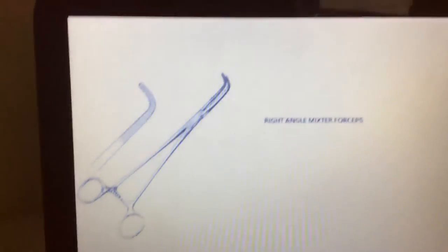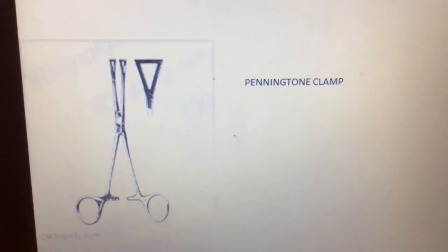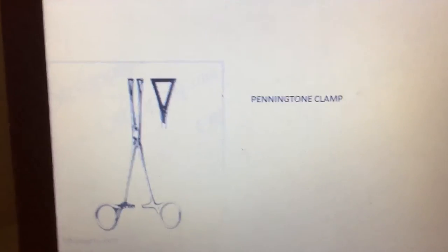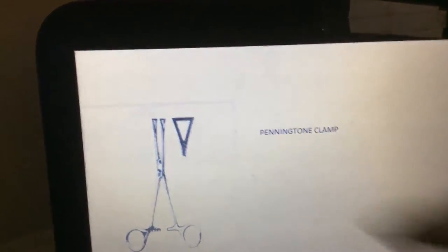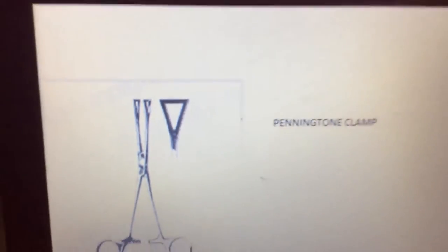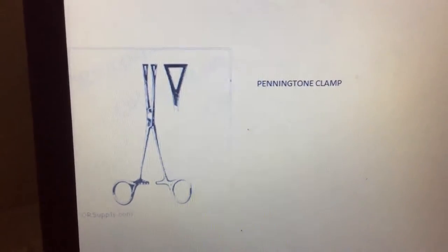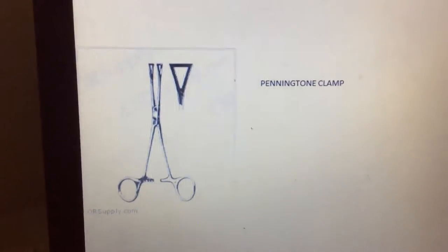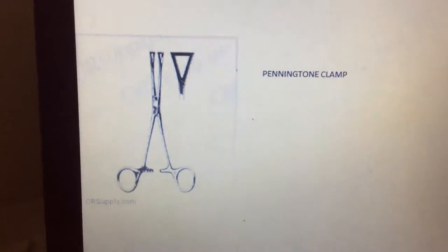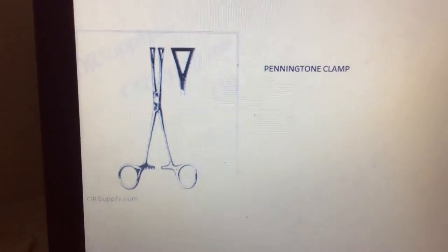This one is the Pennington clamp. As you can see, the tip is a triangle shape. This clamp is mainly used for clamping tissue, especially in intestinal and rectal operations. It is used for holding tissue, especially in intestinal and rectal operations.